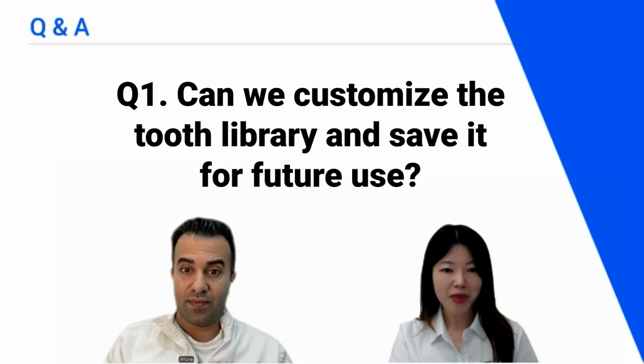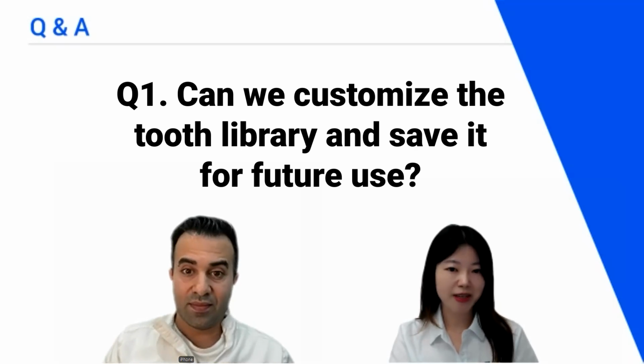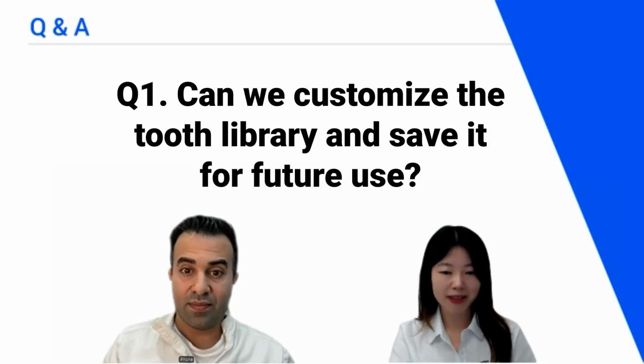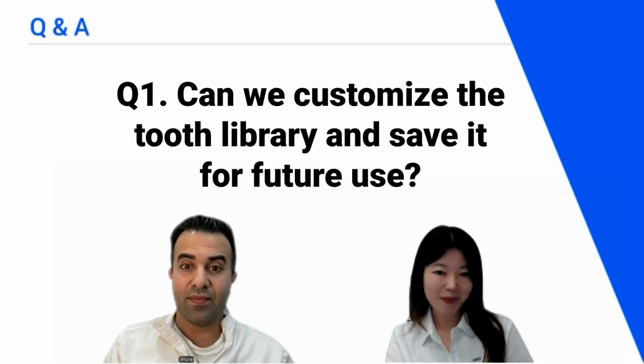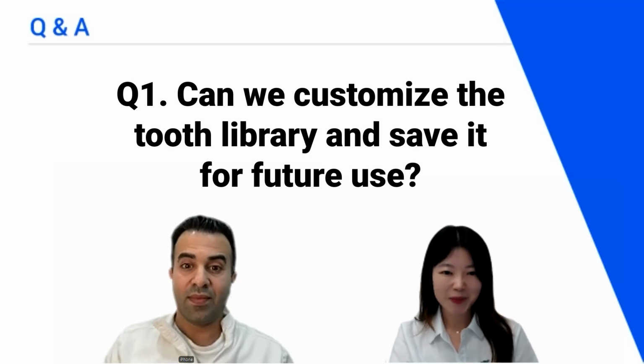Oh, I think everyone must be so curious about the customized tooth library. So maybe that would be so great if you can deal with it next time. 100%. Yeah. Okay. Next question.